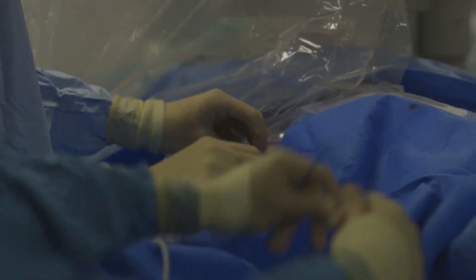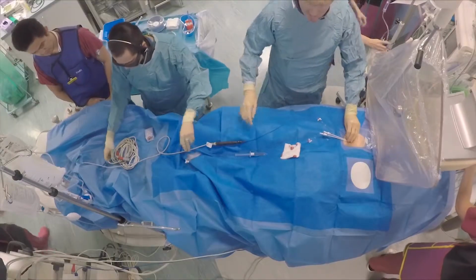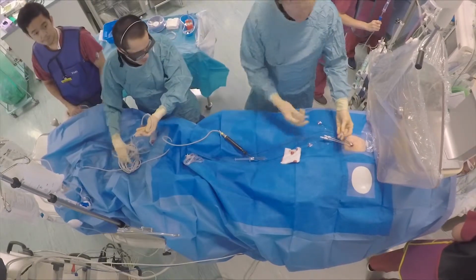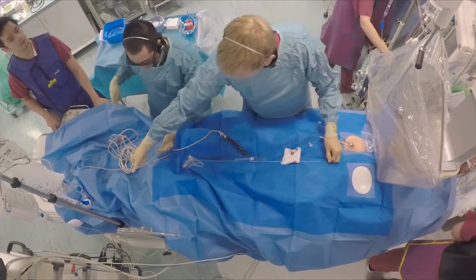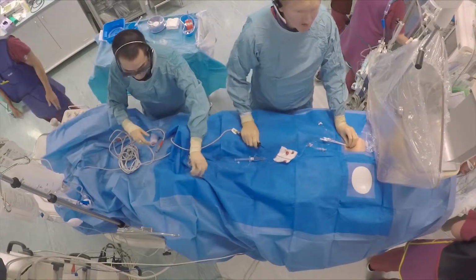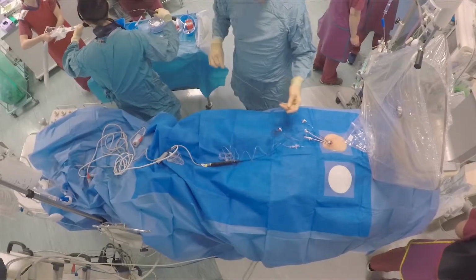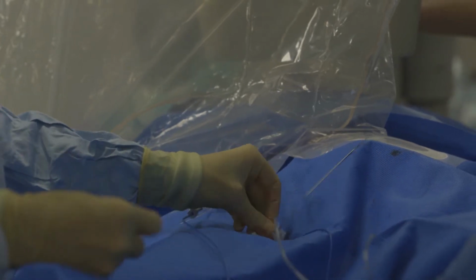Once the coronary sinus catheter has been placed within the coronary sinus, I immediately put the ablation catheter onto the cava tricuspid isthmus. The reason for doing this is the cava tricuspid isthmus is very close to the diaphragm, and therefore there is normally a lot of movement with respiration that the CARTO system is able to pick up on. This means that respiratory gating can be done accurately and quickly whilst I'm getting on with doing the transeptal puncture.